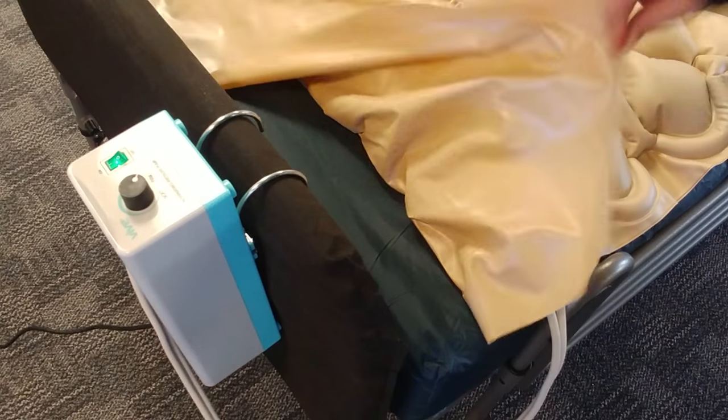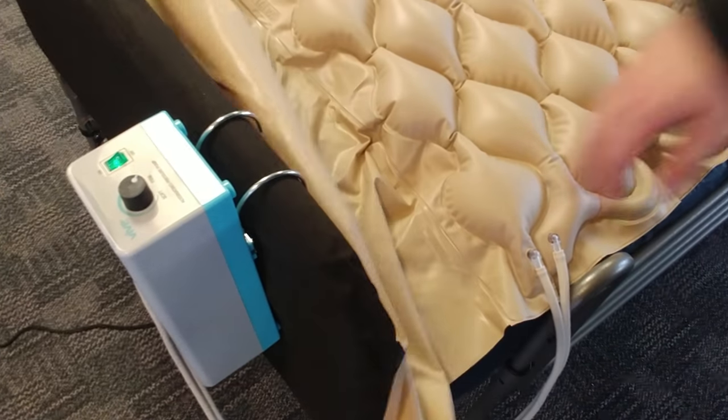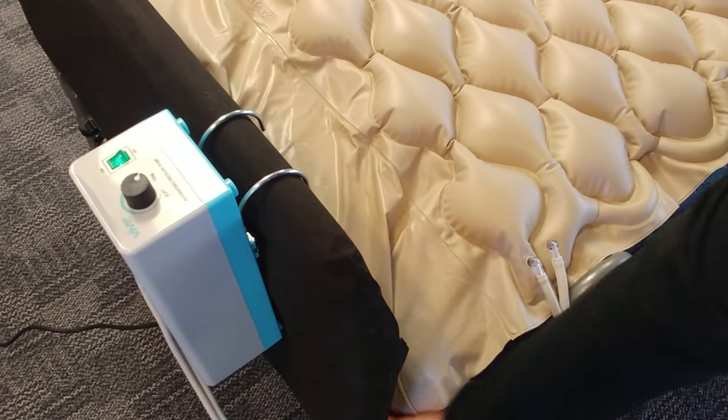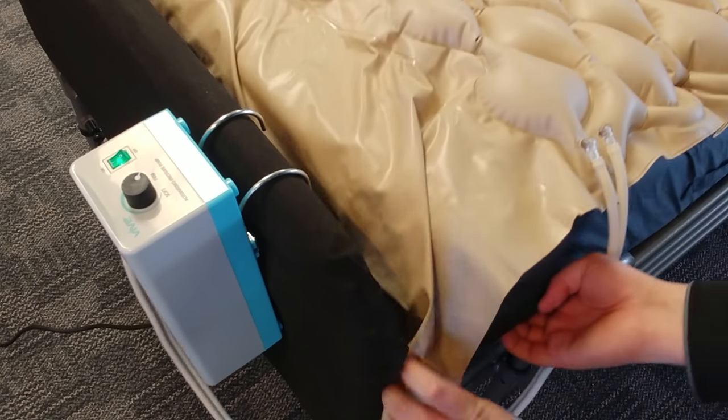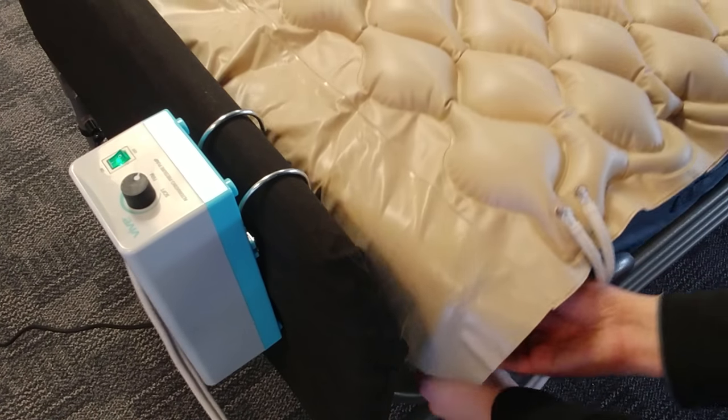There is this uninflated section of the mattress. What you'll do there is just tuck that underneath the mattress itself. That'll help keep everything in place and keep the mattress from shifting around.